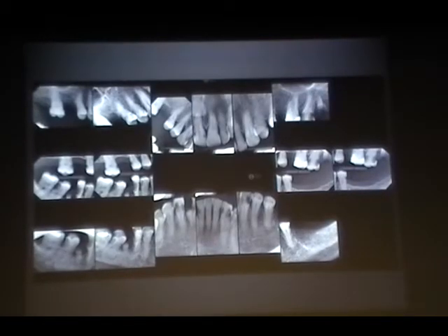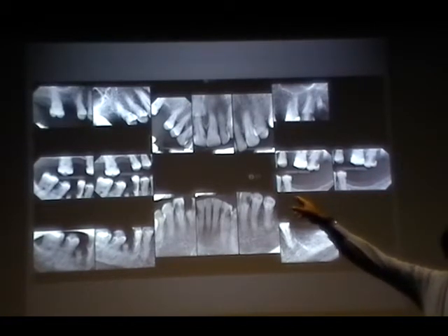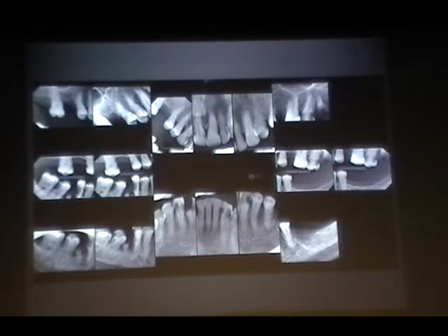How about the next one? Okay. Fast. It might be too anterior, considering you're supposed to... Wait. This is the next. We're talking about the top one, right? Yes. Okay. It's too anterior. It might also be too far incisal, considering how close the apex is to the edge of the frame. I think that looks good to me.